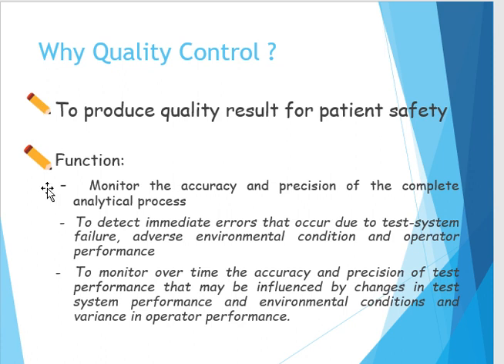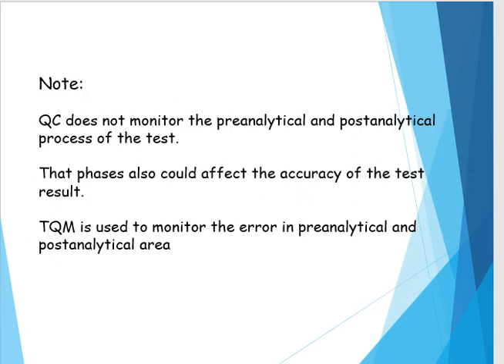So the function of QC, as in this slide, is to monitor the accuracy and precision of the complete analytical process, to detect immediate errors that occur due to test system failure, adverse environmental conditions and operator performance, to monitor over time the accuracy and precision of test performance that may be influenced by changes in test system performance and environmental conditions and variance in operator performance.